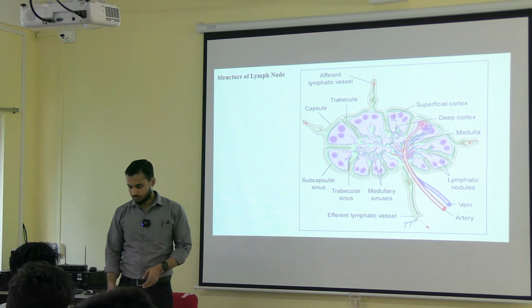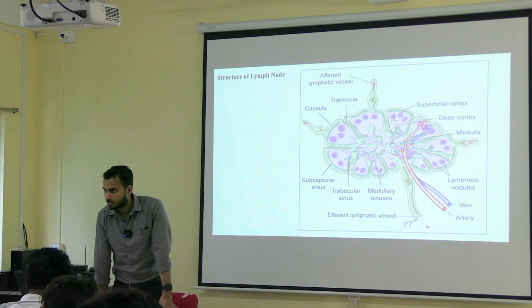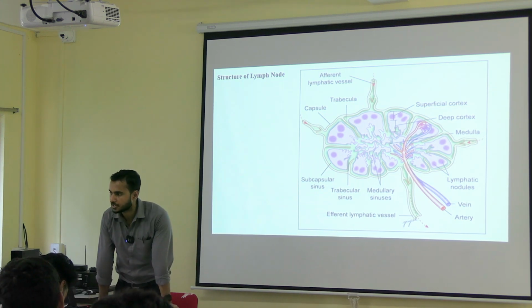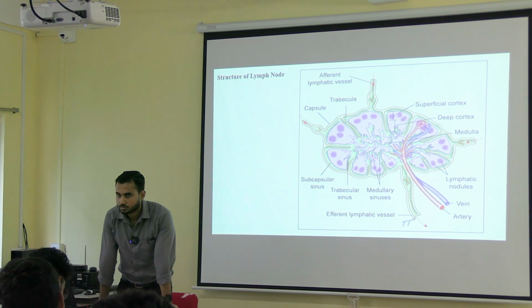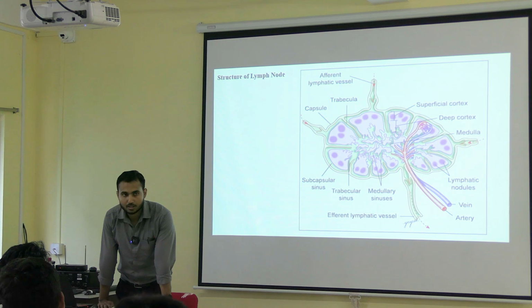No. RBC inside lymph node will get separated. Nah, spleen nah. This is lymph node. Now you are in lymph node. Spleen is done. The answer is very simple, and because of the transportation of the lymph.